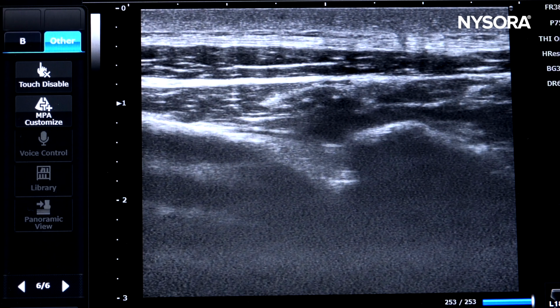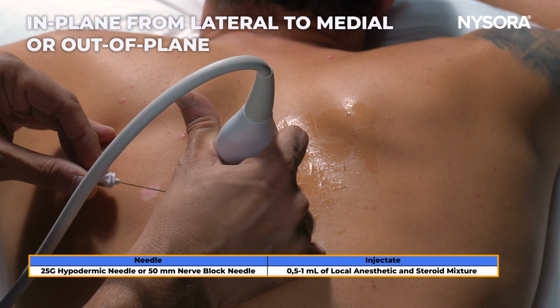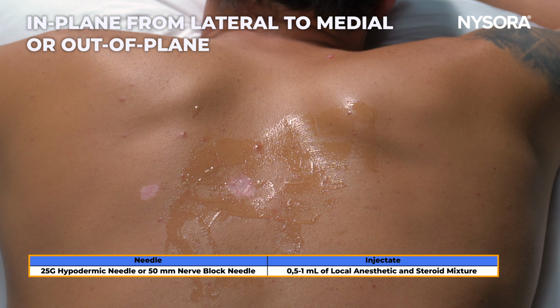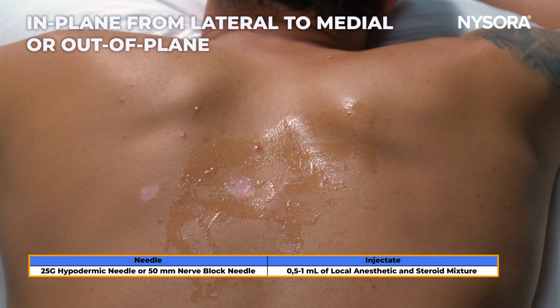This is the transverse process, it's a rib, and costotransverse joint injection can be performed in plane, coming from lateral to medial, going below the ligament. This ligament can also be the pain generator, so it's always sensible to inject in the ligament and also in the joint, and this will be the position of the needle coming in for the costotransverse joint injection. The joint volume is very small, so about 0.5 cc to 1 cc of local anesthetic and steroid mixture should suffice for this injection.